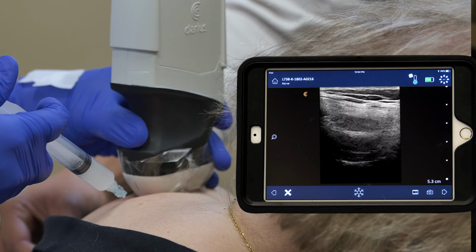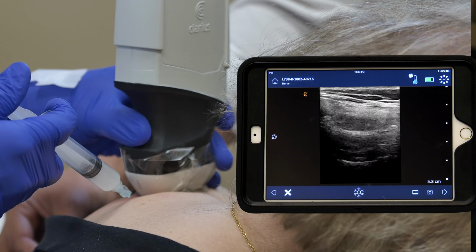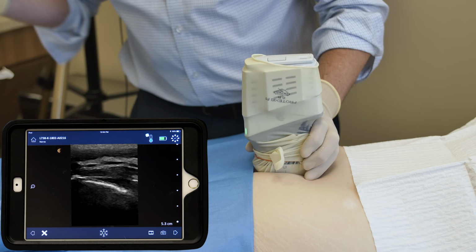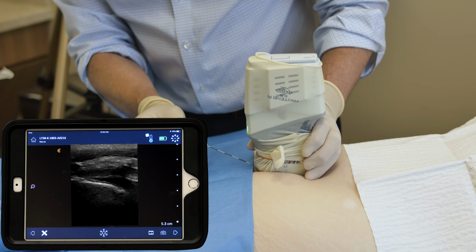Ultrasound image quality is extremely important when performing an ultrasound-guided nerve block. It helps me visualize blood vessels, nerves, or other vital structures that I wish to target or avoid during the procedure. So you're all done. It's quite often that I perform a procedure and see a blood vessel next to the nerve that I'm targeting. The ultrasound enables me to avoid the blood vessel and deposit the medication around the nerve.